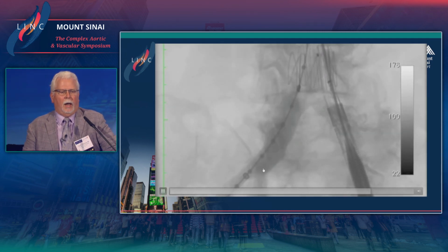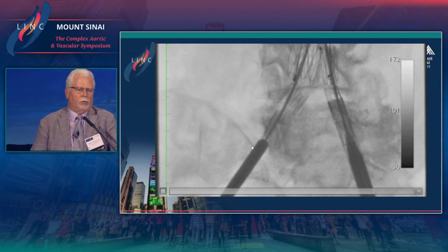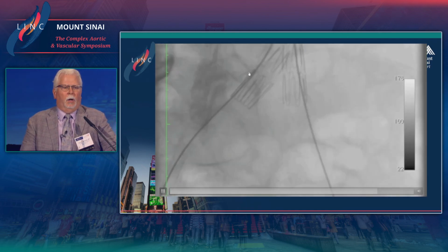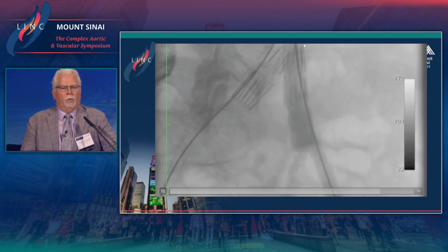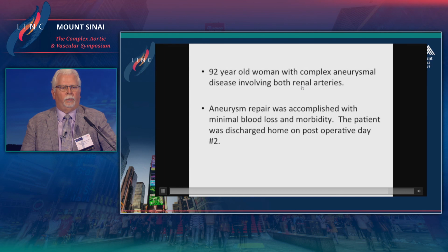Here, we put a marker catheter in, see the origin of the hypogastric artery, and then we'll just bring a covered iliac stent down to the origin of the right hypogastric artery, and then balloon the interface between the two. Once you've done that, you'll deploy the ipsilateral limb coming down, and then you can build down further if you need to give you a good seal going to the hypogastric. Here's your completion angiogram showing good flow going to celiac, SMA and the renals.